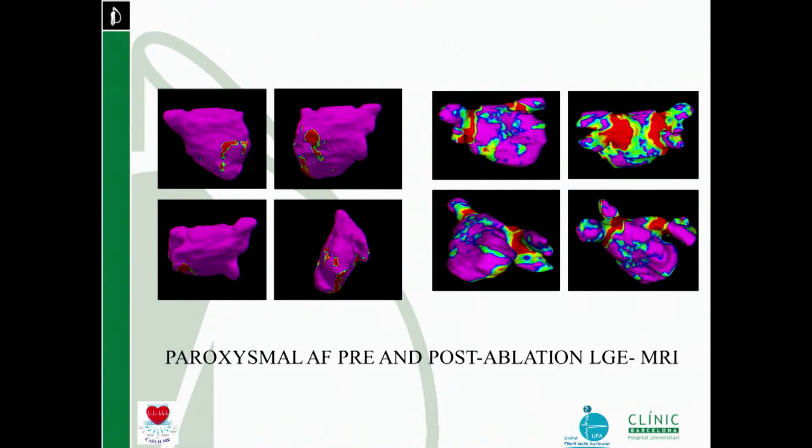And those are some examples. This also goes with the comments that Dr. Cox has made about what the electrophysiologists call a line. If you consider that a line, you are very geometrically deformed, because it's really not a line. It's a very extensive lesion that you are doing.